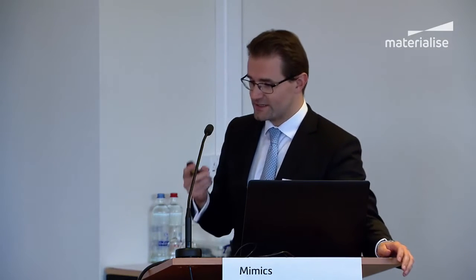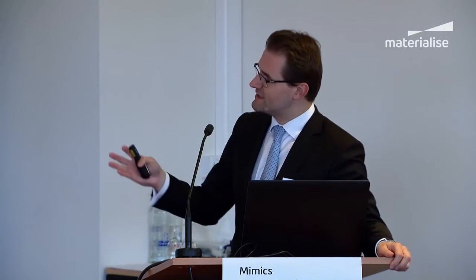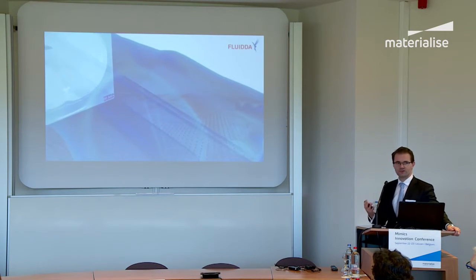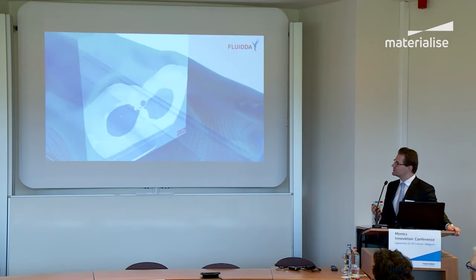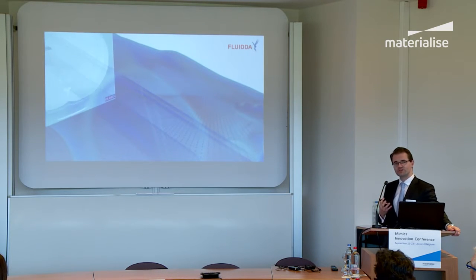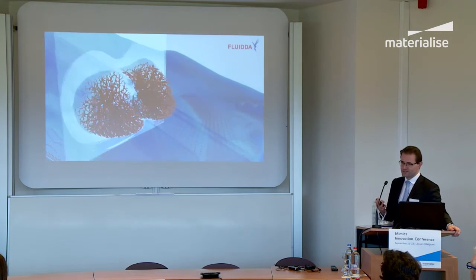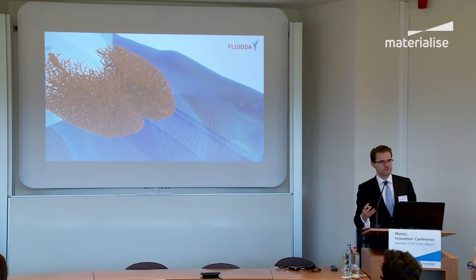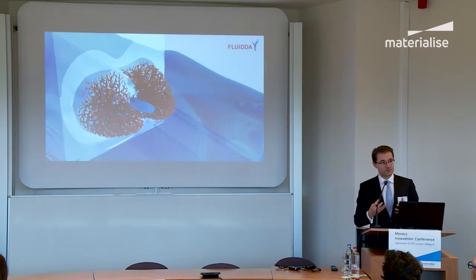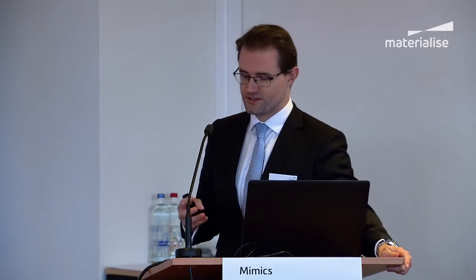So these two scans are then sent to our servers, so the data is centralized, and we look at the internal structure of the lung. And we like to go beyond the subjective interpretation by a radiologist. So what we do, and I think that was also the theme of today, we extract the anatomical structures out of these images, we visualize them in 3 dimensions, but we again quantify them. So you visualize them, but you turn them back into numbers, and you can use these objective numbers to assess either the disease progression or the effect of interventions.